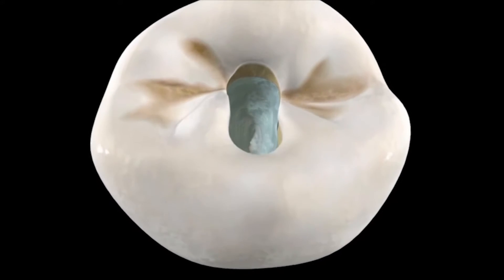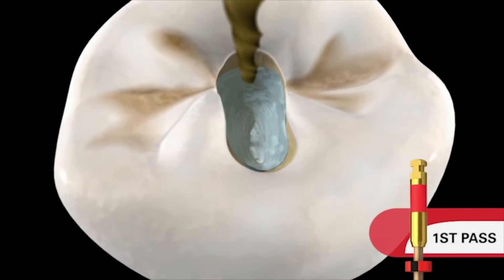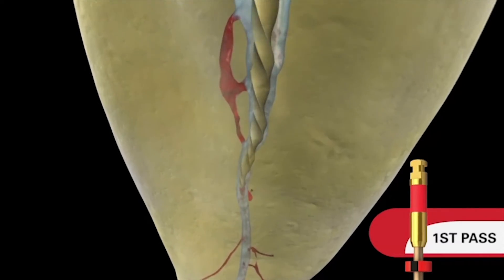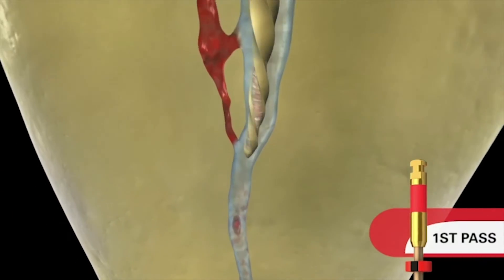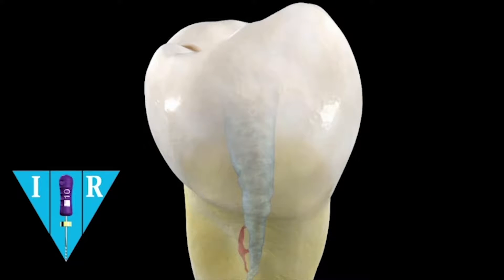We have a glide path and it's been verified, so we can come right in with the primary 2507 Wave One Gold instrument. I want to really emphasize multiple passes — the instrument should only work for about three or four millimeters and then it should be removed. There should be a lot of debris towards its working tip as it's crowning down. After every instrument is removed, we irrigate to kick out gross debris.